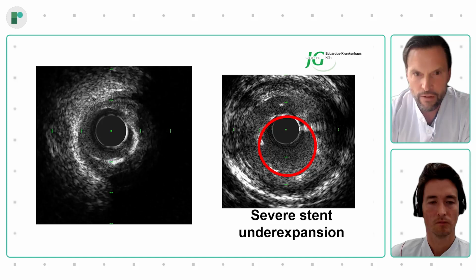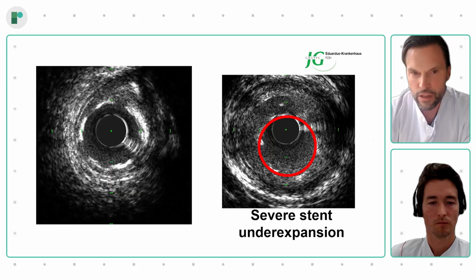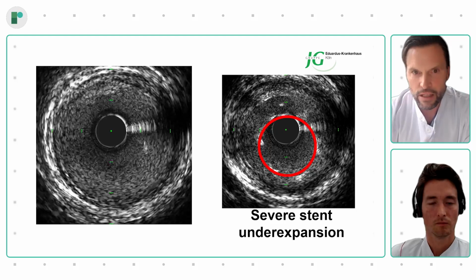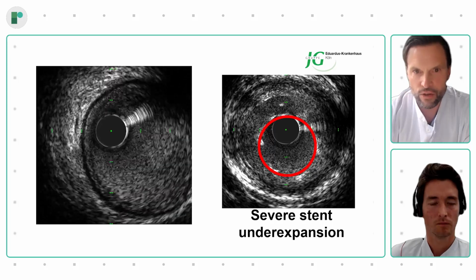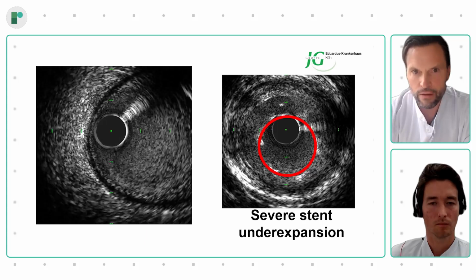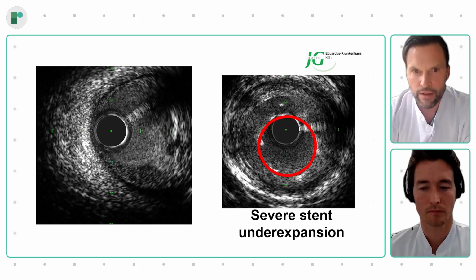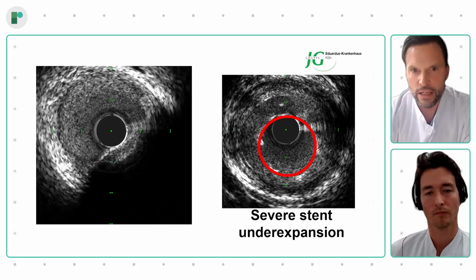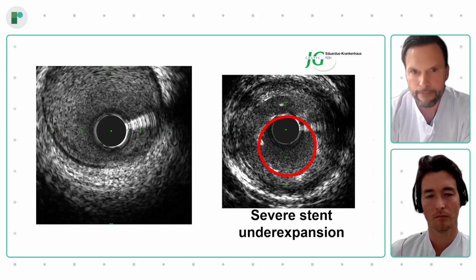And this brings us always back to the fact that in a perfect ideal world, you should use both modalities in every patient, and especially if you have an ambiguous situation. And this is what is stated in the guidelines: you should use IVUS to solve the problem, to understand the lesion. And if you understand the lesion, then you can decide in an ambiguous situation if you really need additional hemodynamic information, or, like in this case, that you should proceed, of course, with interventional treatment.